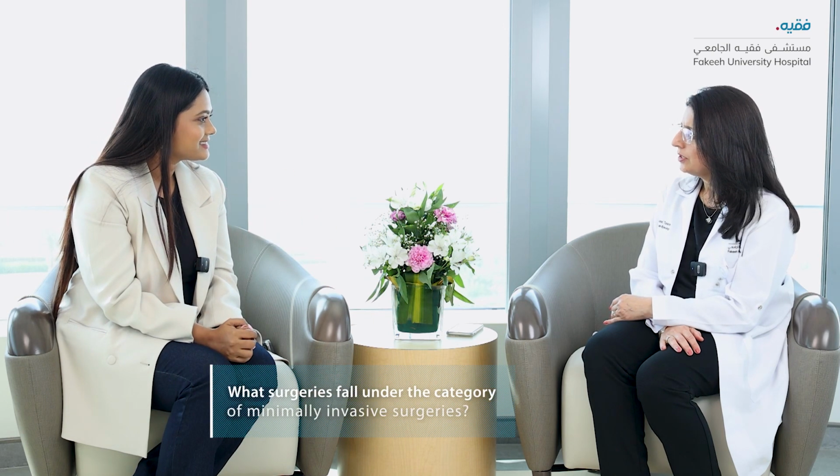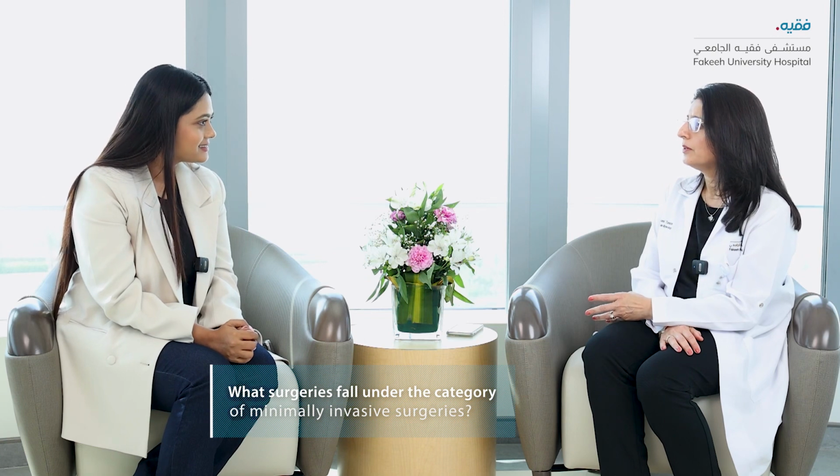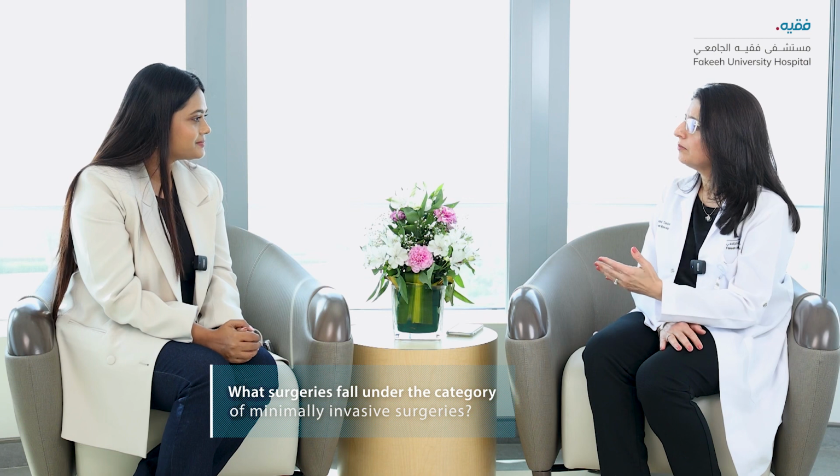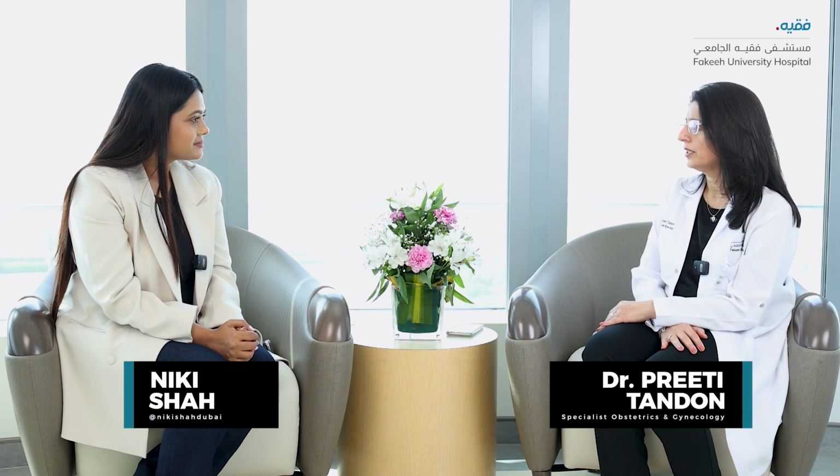So now that you mention less pain and faster recovery, tell me what all types of surgeries can be covered under this? We can do surgeries hysteroscopically to remove fibroids, to remove any polyps. Women face a lot of bleeding problems. Those can be diagnosed and treated through a hysteroscope, where there is no cut, no incision on the abdomen also. They're hospitalized in the morning, they undergo small, short duration anesthesia, the procedure is done, and the same day evening the patient can go home.